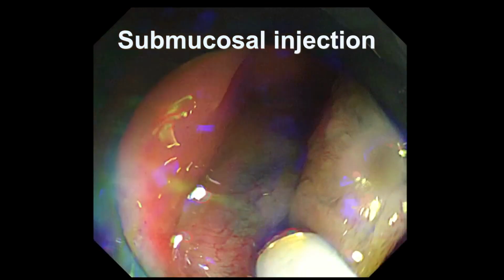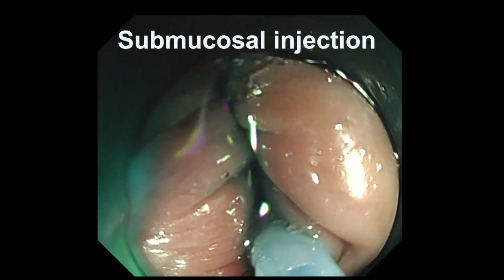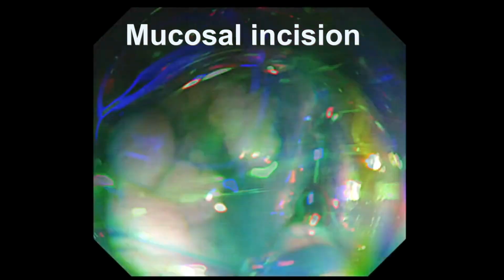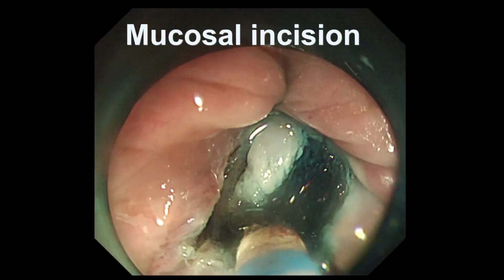First, we performed submucosal injection around the tumor. Then we did mucosal incision and created the flap.